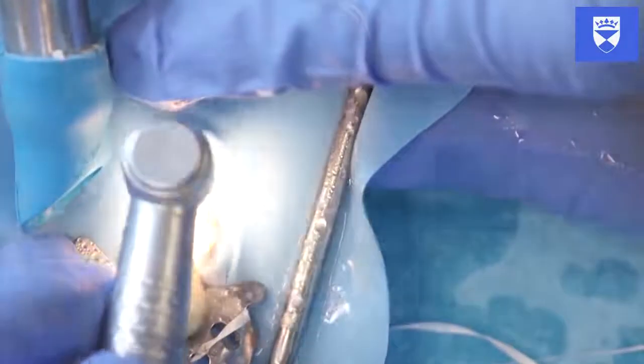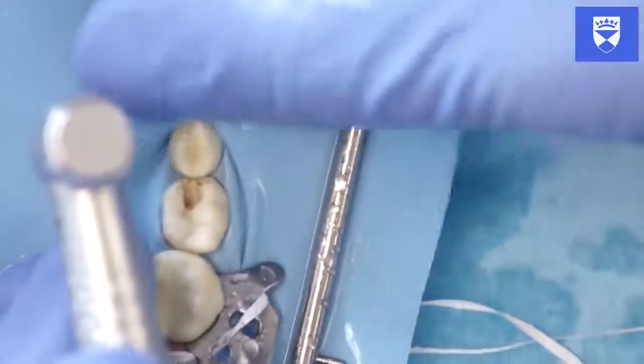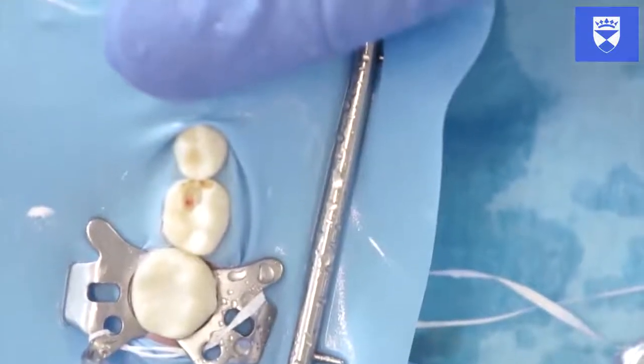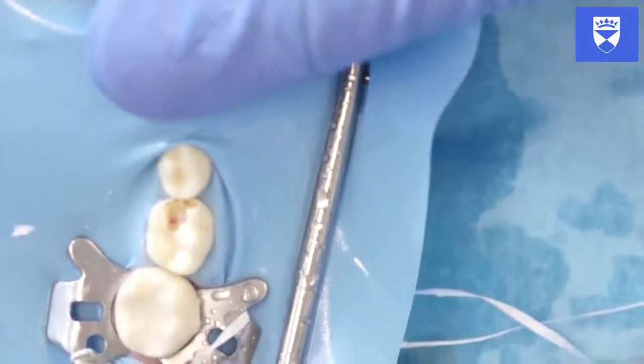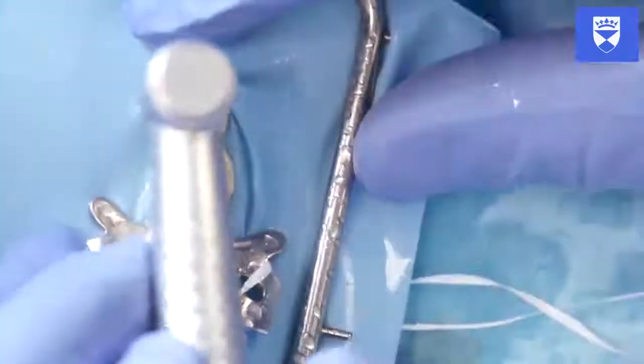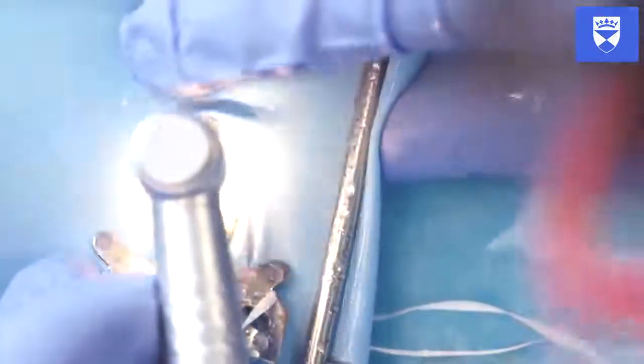Deepen the cavity and remove the caries overlying the pulp chamber. Widen the cavity sufficiently to ensure access to the pulp horns. These are usually located in the corners of the tooth. Gain access to the pulp chamber using the high-speed handpiece with the diamond burr. Ensure that all the overhanging dentin is removed.